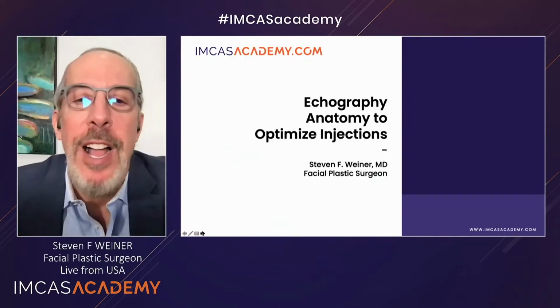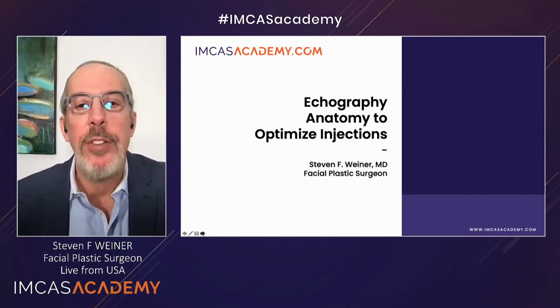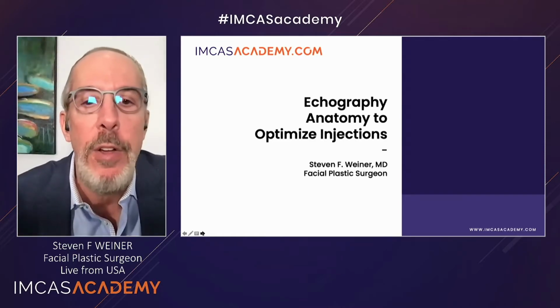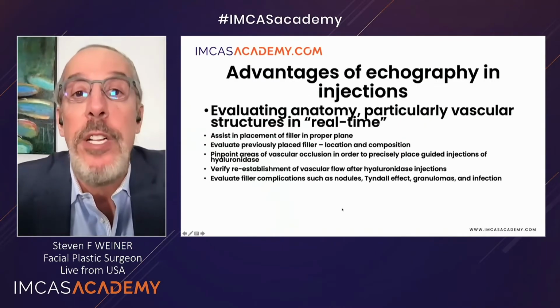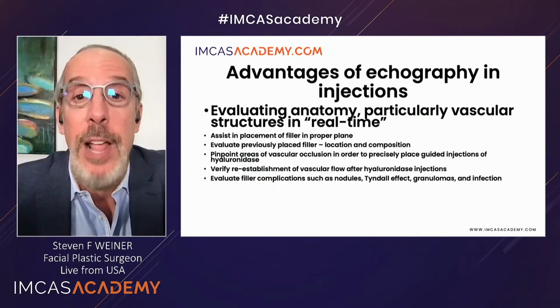All right, so I'm Dr. Weiner, and thank you for having me today. What I'm going to do is go through echography, or ultrasound as we call it in the United States. I'm going to go from head down and go for the critical areas of anatomy here. So what can you do with ultrasound? Basically, we're going to discuss the anatomy and vascular anatomy in real time on our patients.